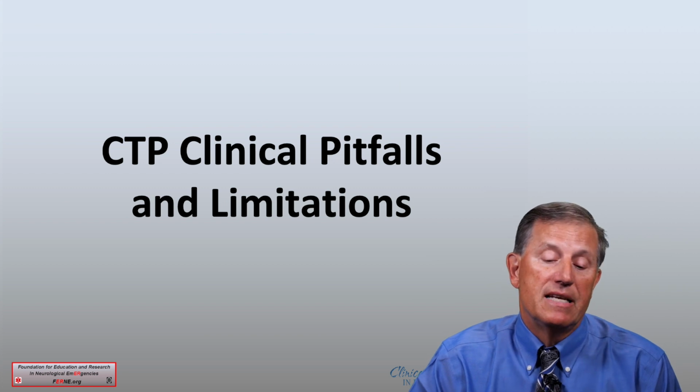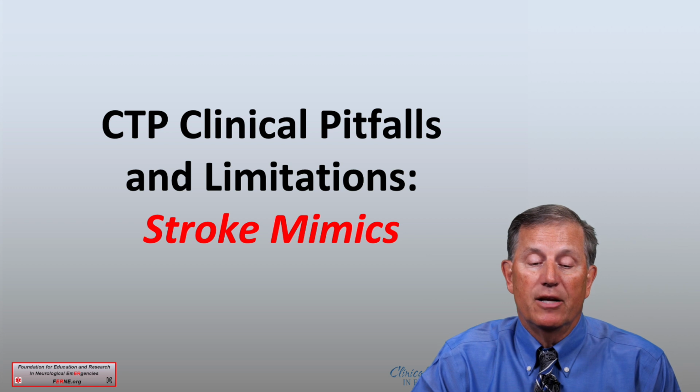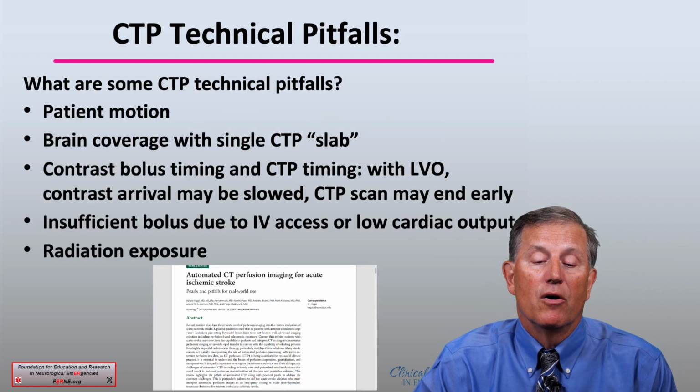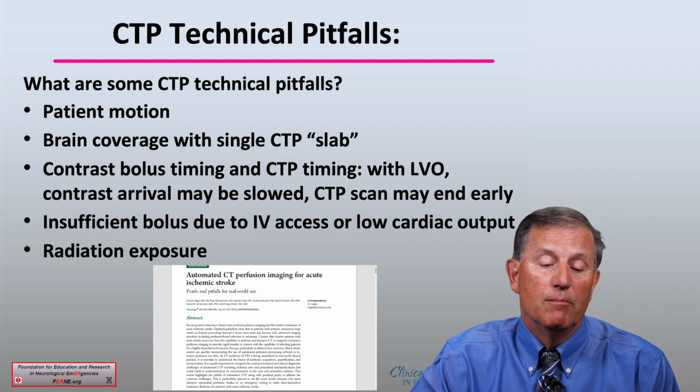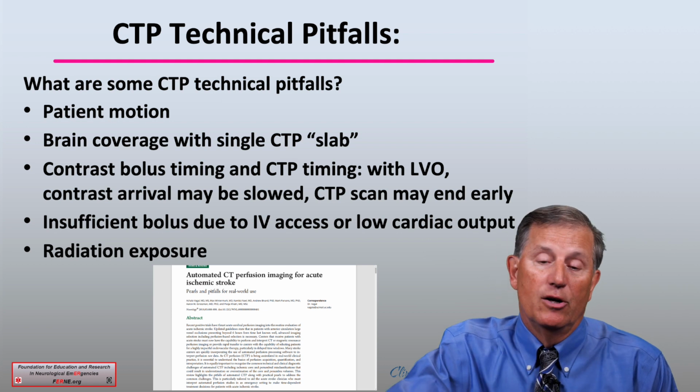And what are some CTP clinical pitfalls and limitations? The first to consider is stroke mimics. What are some technical CTP pitfalls? Well, the patient may move. The brain coverage is provided with a single CTP slab or a single look.